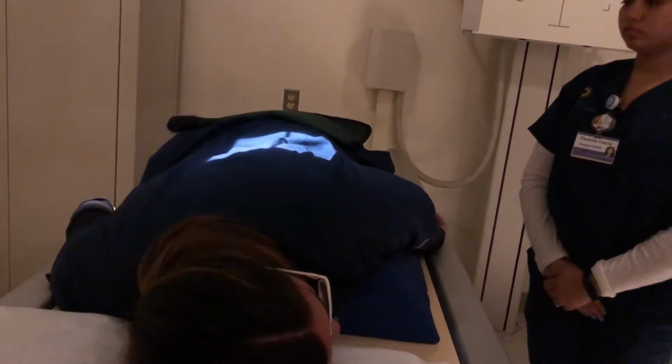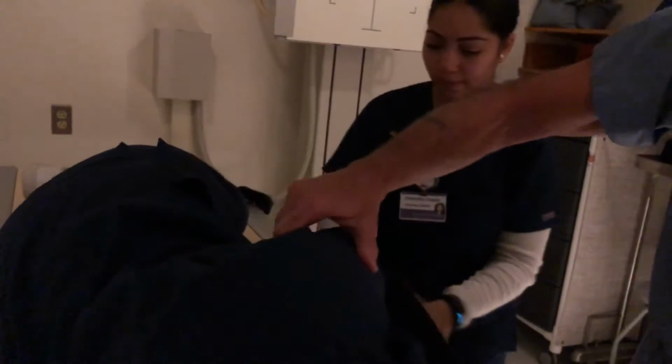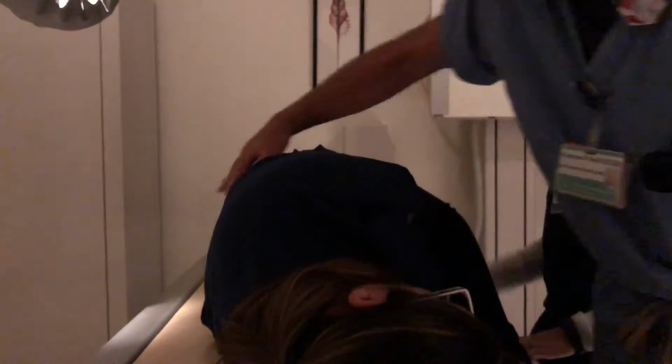Next view we're doing is a lateral. So there's always going to be a right lateral. Just going to turn all the way on her right side. We don't want the patient to fall off the table. Always have the patient bend their knees for stability. And we want to put hips and shoulders perpendicular to the IR. Just going to move her up a little bit. Come this way a little bit.